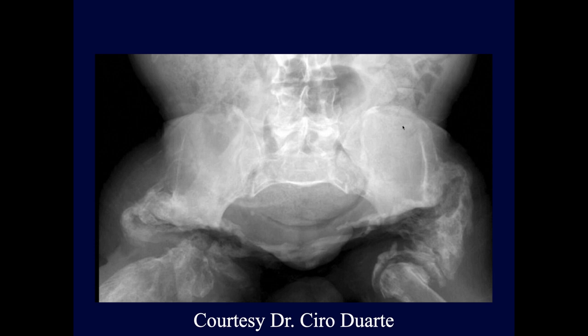So when you see discombobulated joints, what's the first thing you think about? Well, the first thing I think about is just a bunch of chronic fractures in the setting of OI, but if it's not that, in terms of what? Osteogenesis imperfecta. Yeah, but the spine looks pretty good. It does. It's just kind of the hips and the pelvic spine.